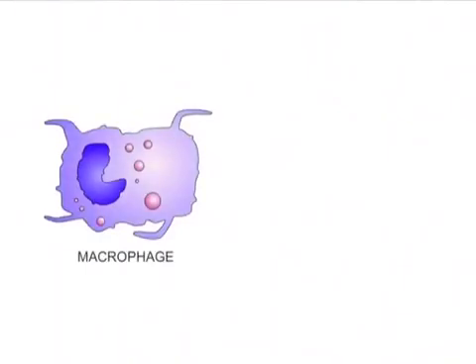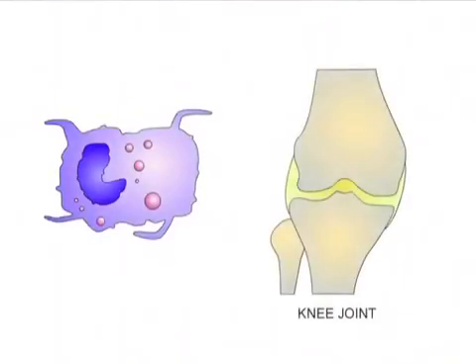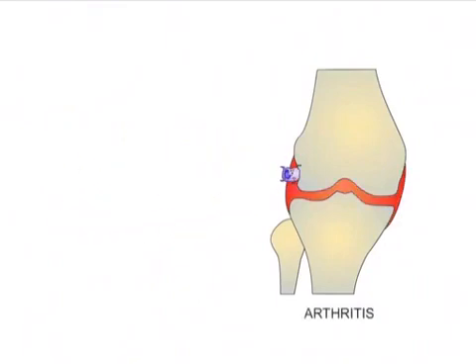Macrophages are key cells in the development, amplification, and resolution of arthritis, especially in septic arthritis. The in vivo demonstration of their presence and distribution within an infected joint could be a valuable tool to monitor antibiotic therapy, as a healed joint is not supposed to be massively infiltrated by macrophages.